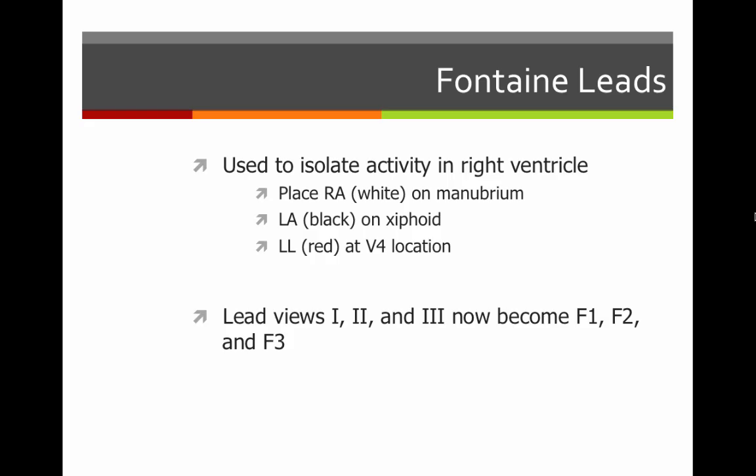And then you go to your monitor, whatever monitor you're using, and view it in lead 1, 2, or 3, and these become Fontaine 1, Fontaine 2, and Fontaine 3 leads. So if you're wondering, is that an epsilon wave or not, switch over to this Fontaine lead, and you'll be able to pick it up immaculately.